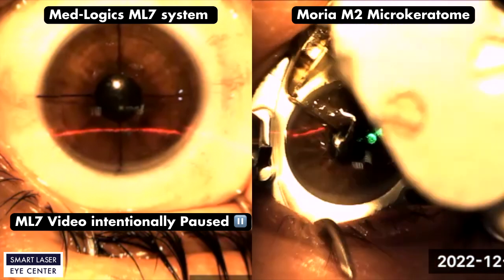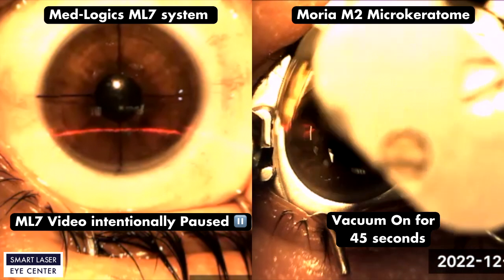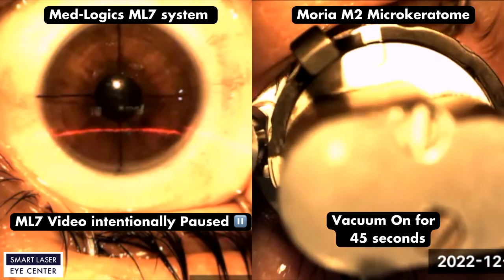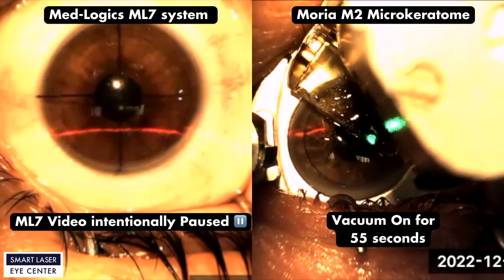The patient eye is still under vacuum, and now the surgeon could move forward after 45 seconds. It is one of the successful forward and back turn procedures. The surgeon could complete the flap in up to 55 seconds.